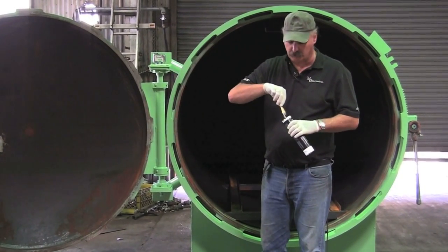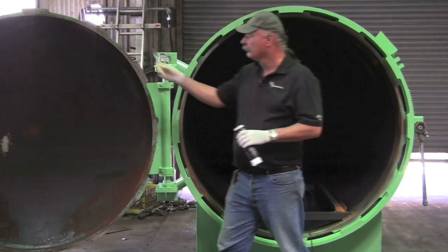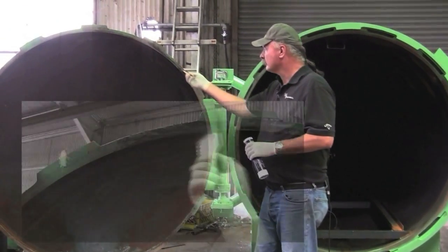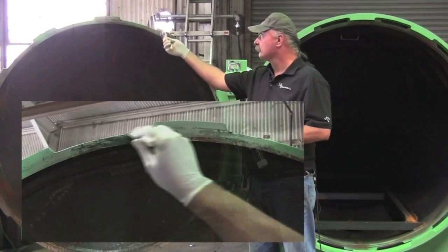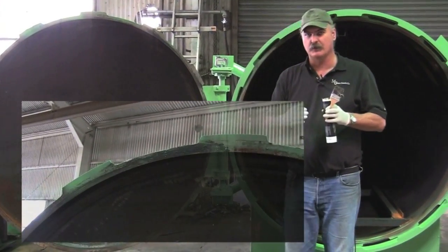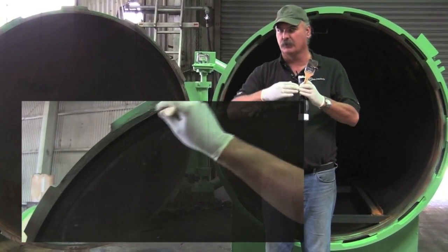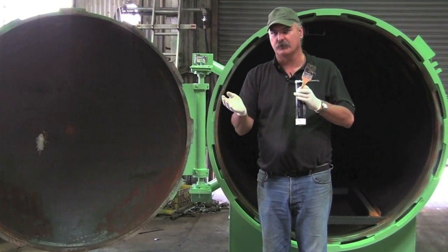The other place you're going to want to grease is the machine surface of the door. You'll want to apply it right on the door itself where the gasket mates against the door. This is a mechanical seal. If it's dry, two things are going to happen. Number one, when it's filling, the seal cannot flip over to create a seal.